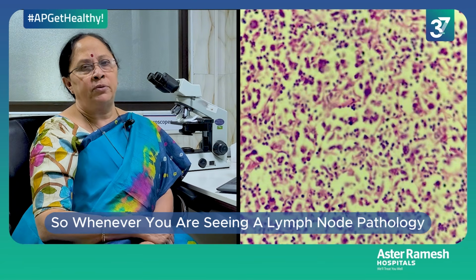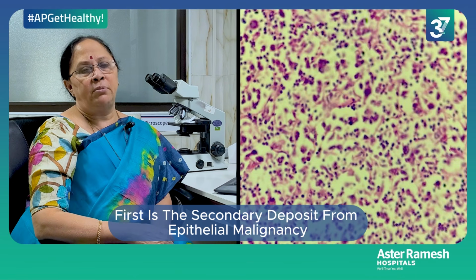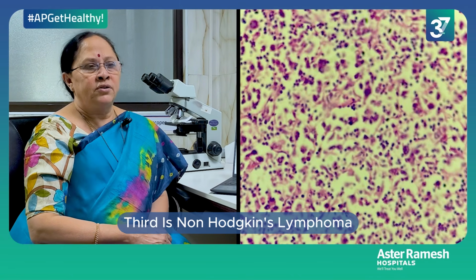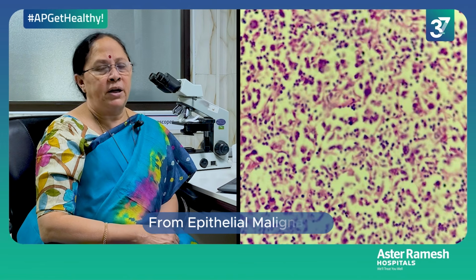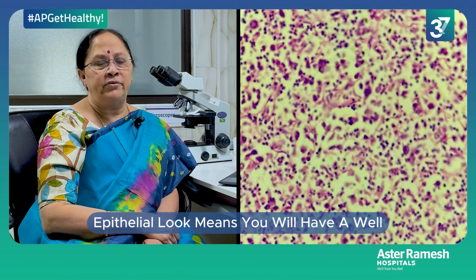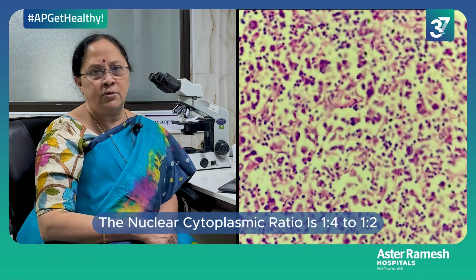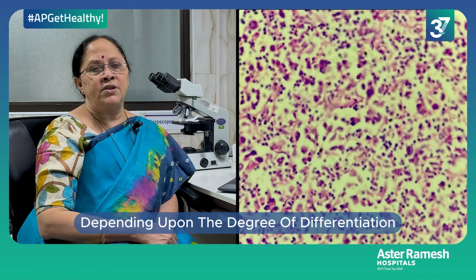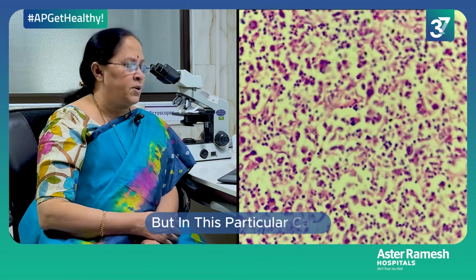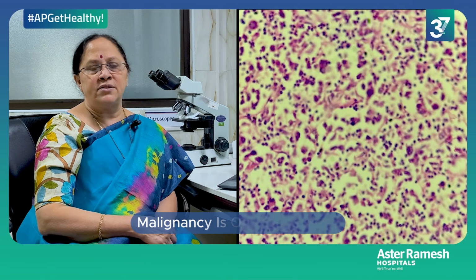So, whenever you are seeing a lymph node neoplastic pathology, the differential diagnosis first is a secondary deposit from epithelial malignancy, then the second is Hodgkin's lymphoma, third is non-Hodgkin's lymphoma. So, first we talk about secondary deposit from epithelial malignancy. In the slide you are not seeing any epithelial look. Epithelial look means you will have a well-defined nucleus, a well-defined cell border. The nuclear cytoplasmic ratio is 1:4 to 1:2 depending upon the degree of differentiation, and the feature of epithelial tumor is some kind of cohesion. But in this particular case, you are seeing all dispersed cells. So, secondary deposit from epithelial malignancy is out of question.